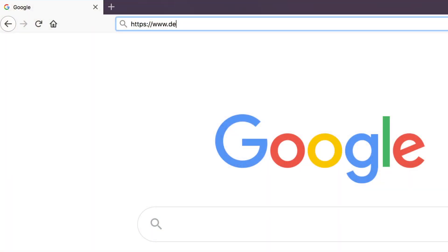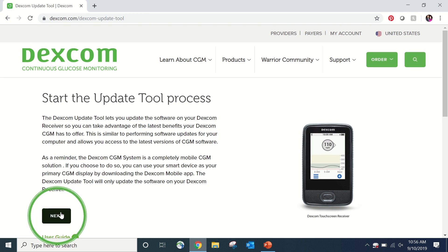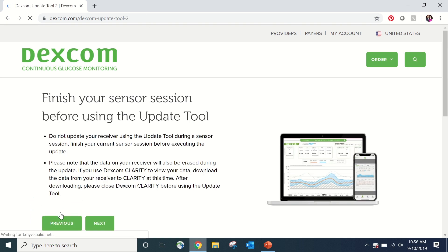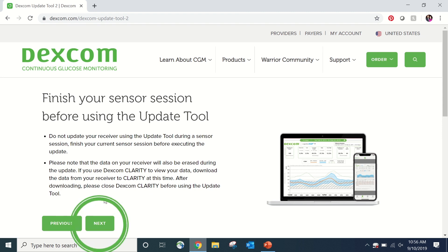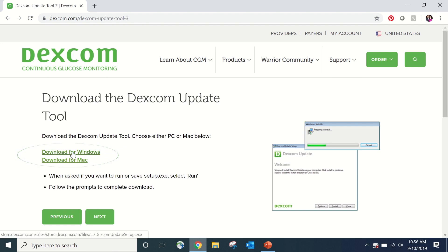Now that you're ready to get started, let's watch Bruce show you how to download and install the update tool. First, go to the web page dexcom.com/update-tool. Following the prompts, click Next to continue to the download page. We're showing you the download for Windows. If you have a Mac computer, the format will be slightly different. Just continue to follow the install prompts.